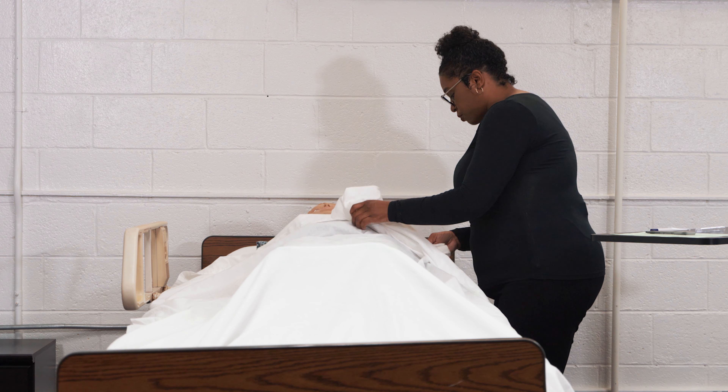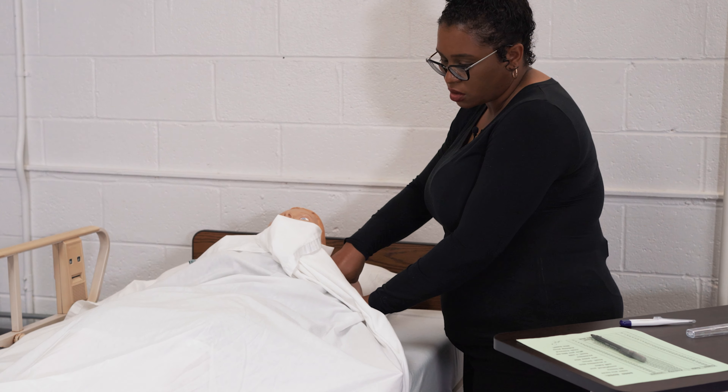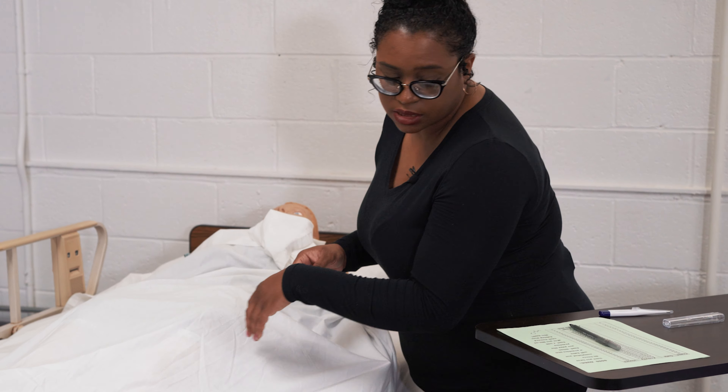Then we're going to dry underneath the armpit to make sure that it's dry with a towel or cloth, and place it on a dirty surface once done.